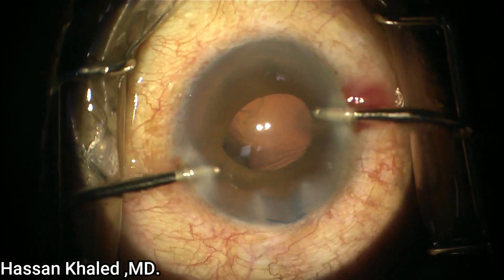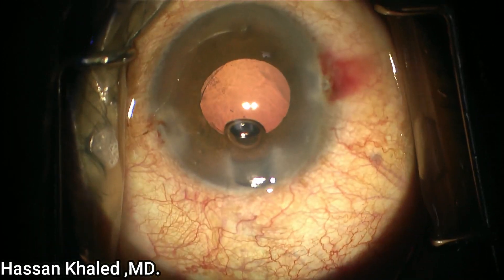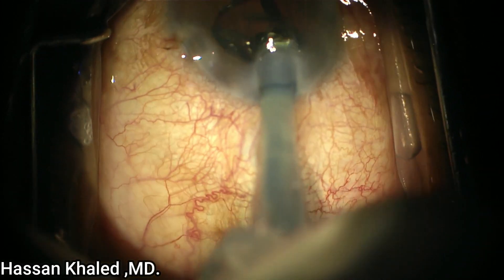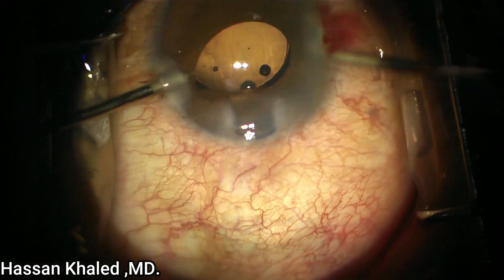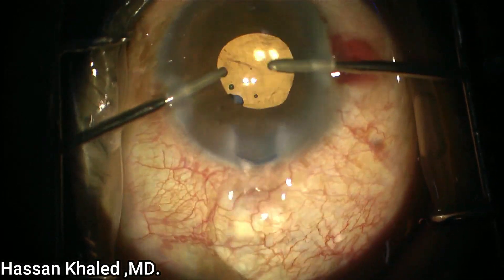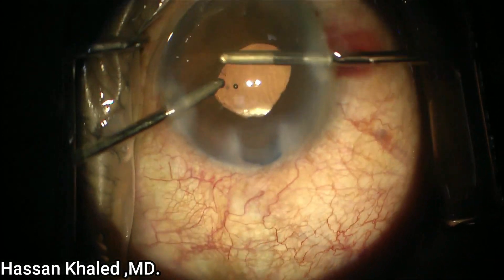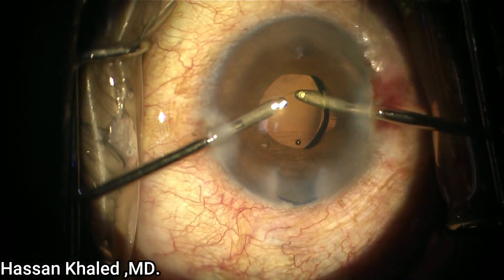Then I am injecting a cohesive OVD to form the capsular bag in order to implant a single-piece hydrophobic IOL. Here is the IOL inside the capsular bag, and I'm using the irrigation-aspiration probe to adjust the IOL inside the capsular bag and at the same time to wash the OVD in front and behind the IOL.